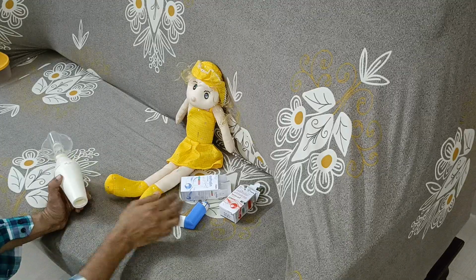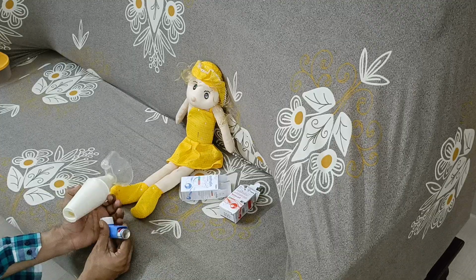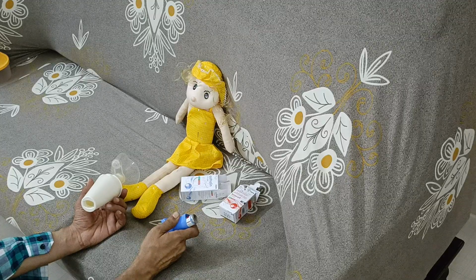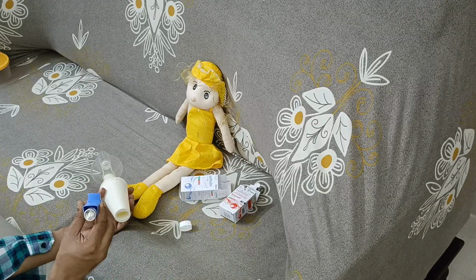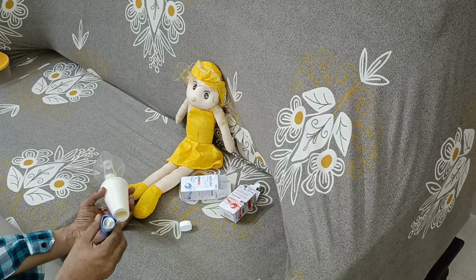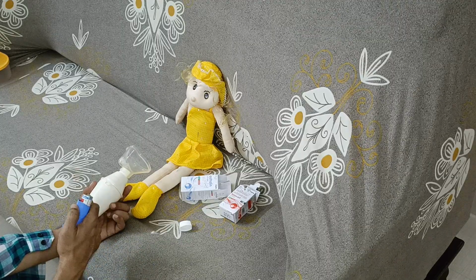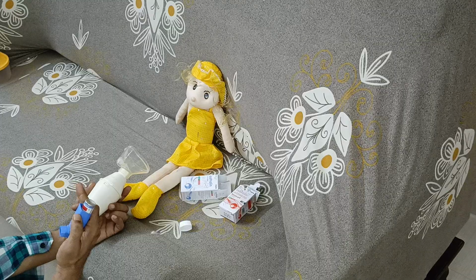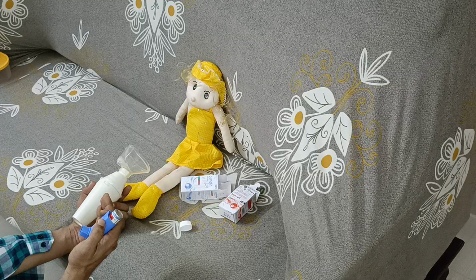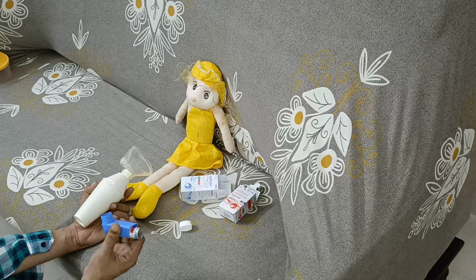And then the next one is the inhaled medicine. This is called a canister, this is the spacer, and this is the mouthpiece. You have to take out the inhaled medicine, the mouthpiece over here, and shake the canister 3 to 5 seconds. You have to count 1, 2, 3, 4, 5. Then you have to teach the patient what to do. Ask the patient to take a slow breath in 2 to 3 seconds and hold it for 10 seconds. If the baby or the child says, I can't do it, then you have to go for tidal breathing. So that's the way it's going to work out.